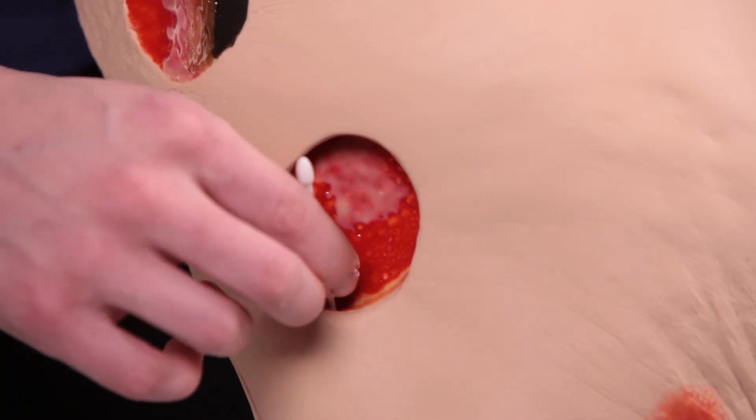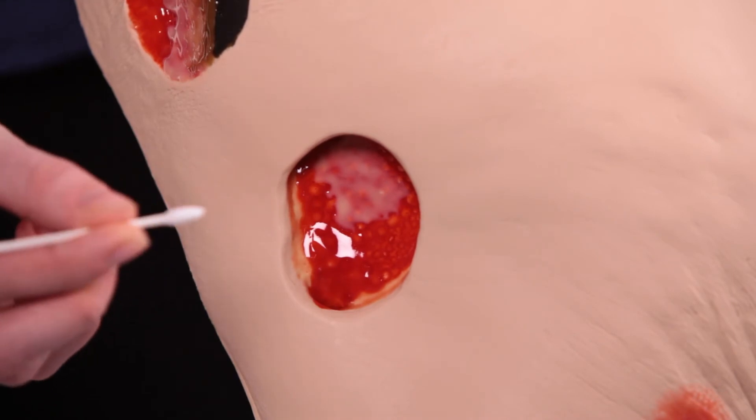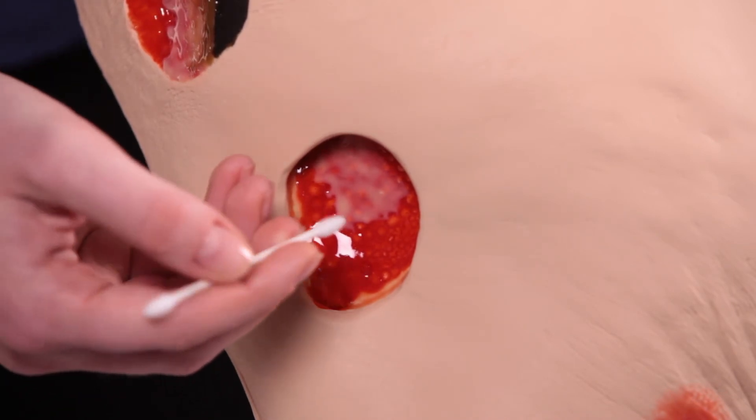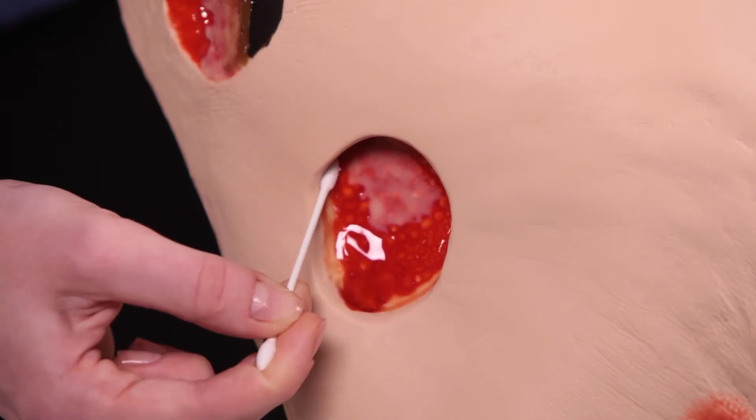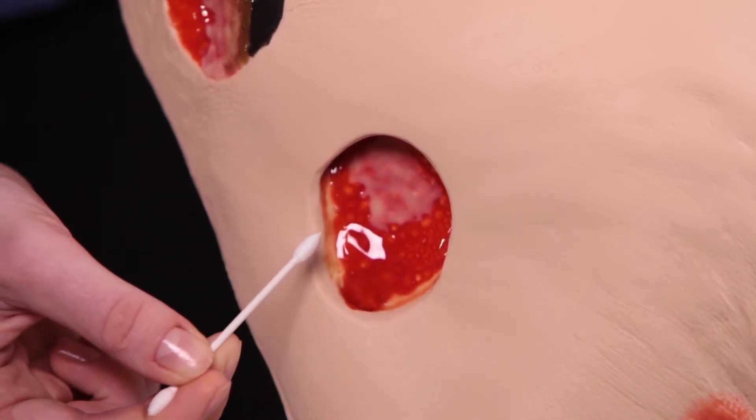Seymour II is also a great tool to teach proper measuring skills, which is critical to ensure all staff are measuring the same way, so that charting is accurate, and with this information the current treatment plan can be evaluated.